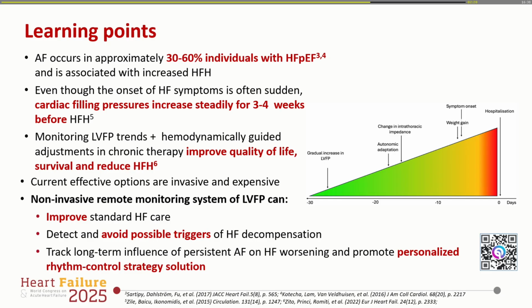So both. As I mentioned yesterday, I presented two cohorts. One were patients who underwent right heart catheterization, so the pulmonary capillary wedge pressure was the gold standard against which we compared our algorithm. And we had another echo cohort, where there was only classification of filling pressures into normal or elevated based on their diastolic dysfunction. But we validated it also against right heart cath. Okay, and this was for both preserved and reduced ejection fraction?